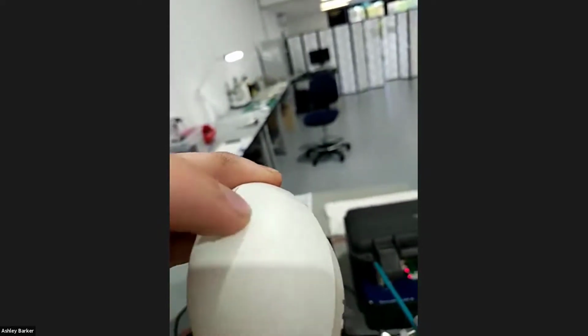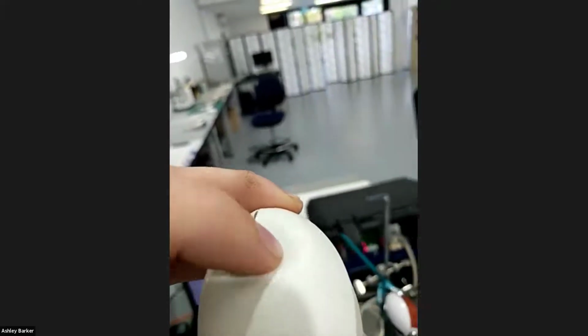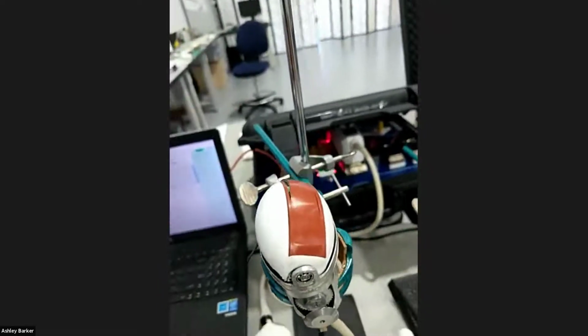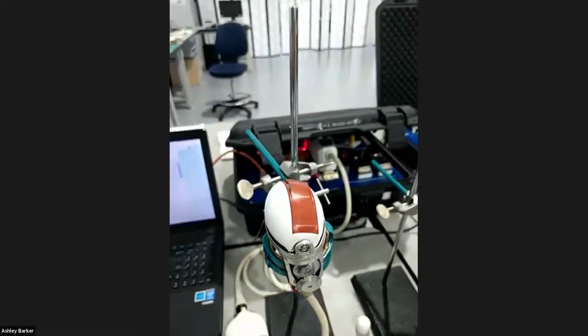Normally it doesn't feel that soft because it's full of oil, and the pressure of the oil helps to stop you feeling that. But that is then right up against that array. So if you drop that, you're just going to smack right into the array, and the armature and everything that has to move there is just going to break.